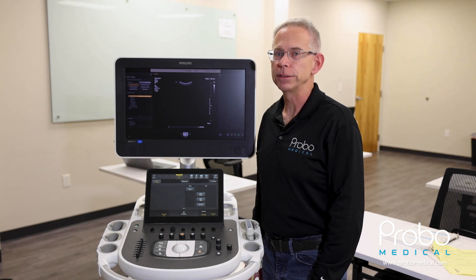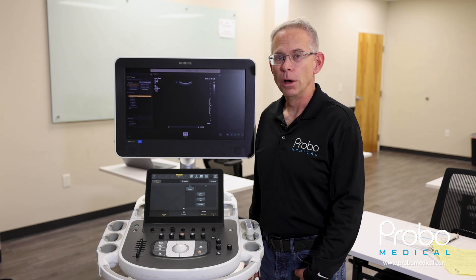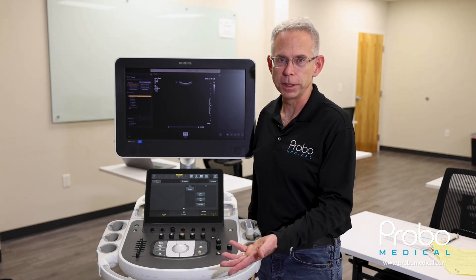Hi, this is Hobie Sears with Probo Medical, and today with another Hobie's Hacks, we're going to show you how to make a preset backup on your Philips EPIQ or also on the Philips Affinity.